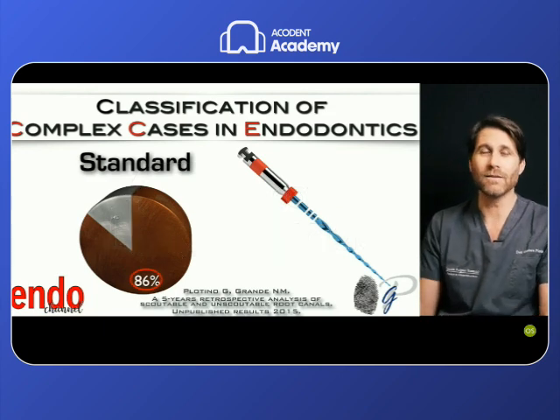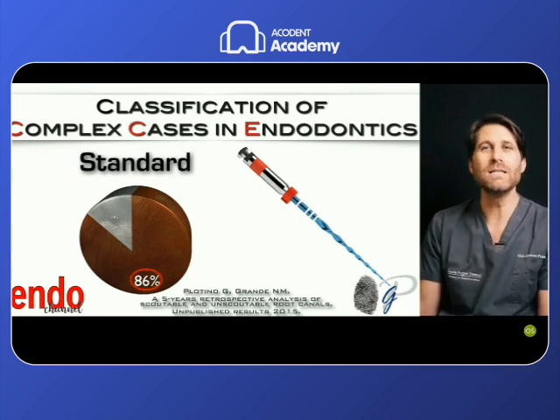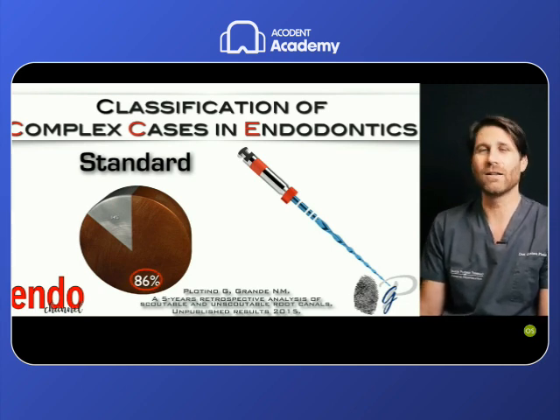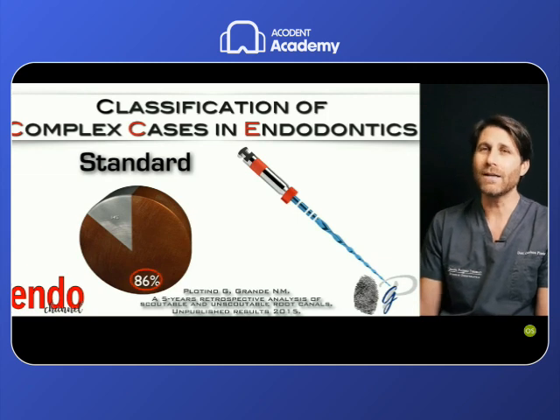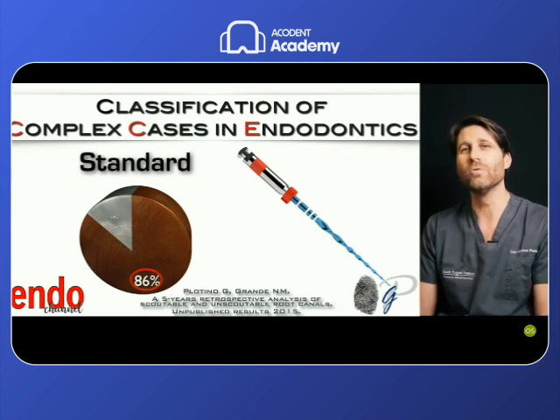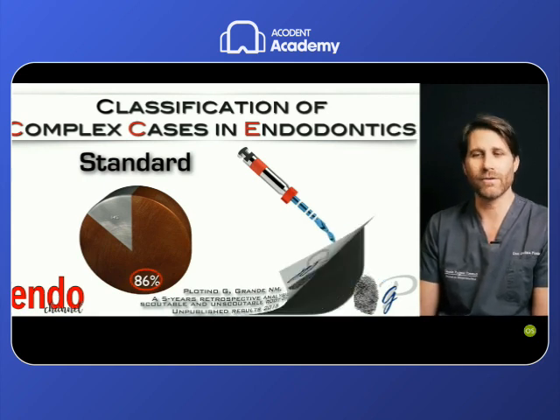Or if we trust in this technique, we can start directly following the manufacturer instructions by using this instrument for the coronal and middle third scouting, glide path, and root canal preparation directly with the Reciproc Blue file, and then pass through an apical scouting as the manufacturer instructs with the stainless steel 10 file, and then use the instrument also in the apical third.